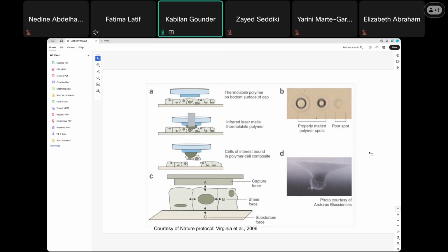So to overcome all this, instead of separating tissues from the heterogeneous mass of tissue samples, using laser capture microdissection you can isolate a single cell from a heterogeneous mass of cells, so it is precise: which cell you are going to isolate and what is the morphology of that cell, or a group of cells with similar morphology. Before you isolate the cells you can take a picture, and also after you isolate. So the photograph will give you evidence of what your source of sample is.